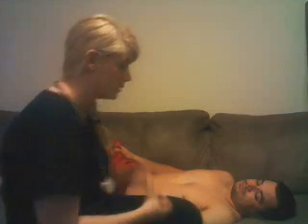Okay, very good. In just a second, I'm going to do that all over again with the bell of my stethoscope. But in between, I'm assessing S1 and S2. I'm trying to assess the rate and rhythm of the heartbeat. Once I'm able to identify S1 and S2, I'm going to really listen carefully to make sure I don't hear any extra heart sounds like S3 or S4. And I'm also going to be assessing for any cardiac murmurs. I don't hear any on this patient particularly.